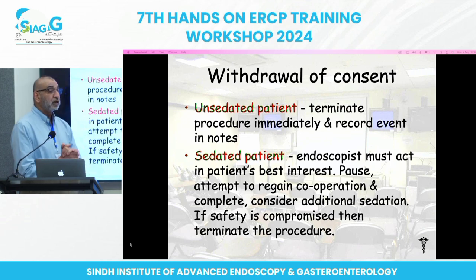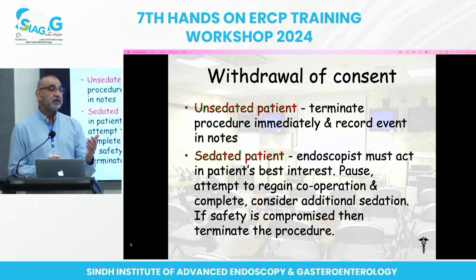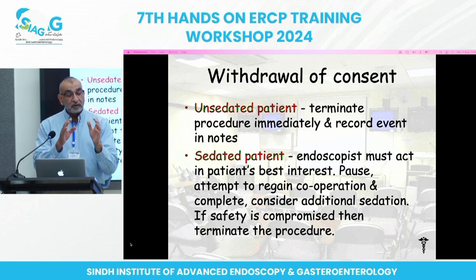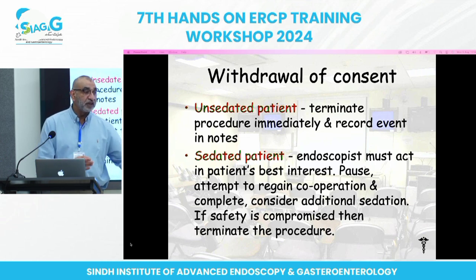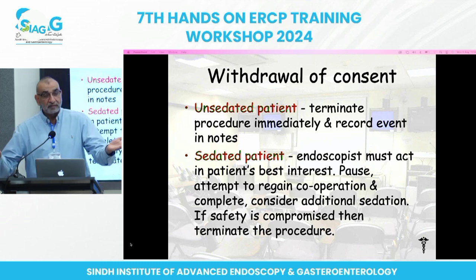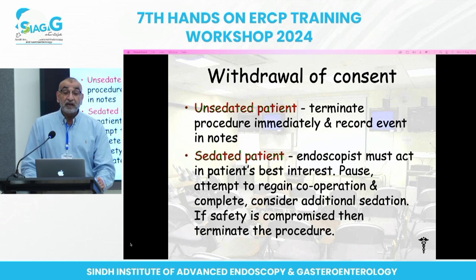Then you have to see how much the patient is aware of what's going on. Secondly, you can do certain maneuvers, like if you insufflated too much air, you suck out most of the air, you put the patient in a better position, you can tell them that, look, I'll give you a bit more sedation, that might make it more comfortable for you. Sometimes that would work, and it's perfectly reasonable to do that. You can give them more painkiller like fentanyl or pethidine or whatever you use. But if that doesn't work, then you must stop, even if they are sedated.